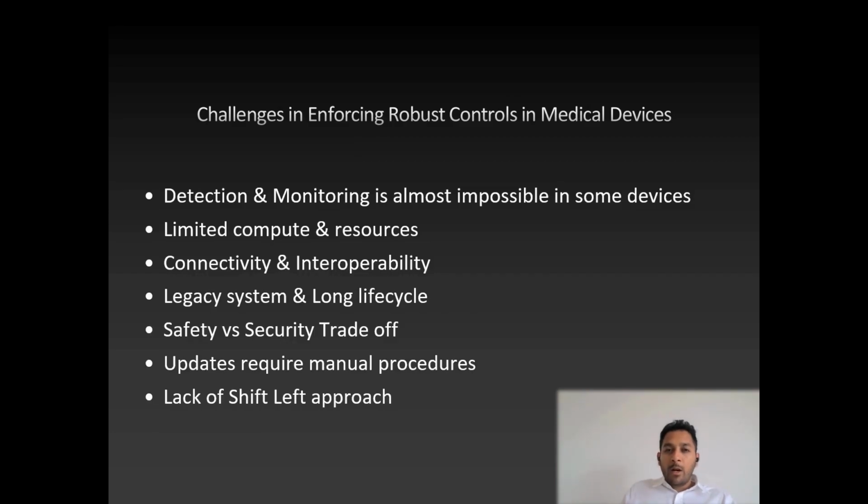All right, finally, we have reached our final slide. I'll talk about challenges in enforcing strong controls in medical devices.